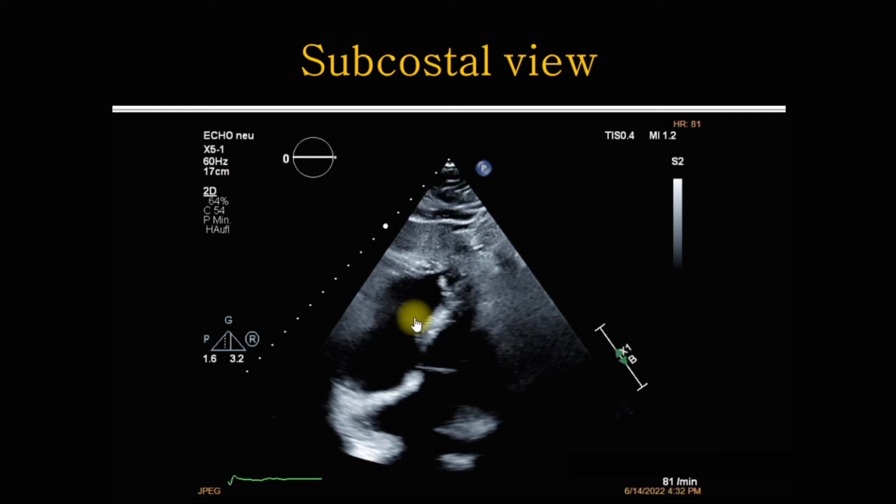This view is very important when the patient has a pericardial effusion. You should see here the effusion. Of course, our patient is normal. We don't see here abnormal findings.